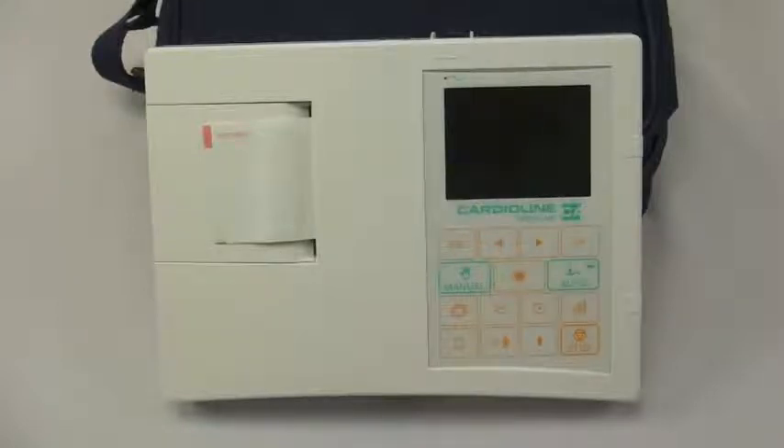The AR600 VIEW is also available with a Bluetooth option that comes with the CardioLine Cube software suite. The Cube software suite allows you to connect to a computer over Bluetooth wirelessly, and you can view the waveforms in real time on your computer screen as you operate the machine.